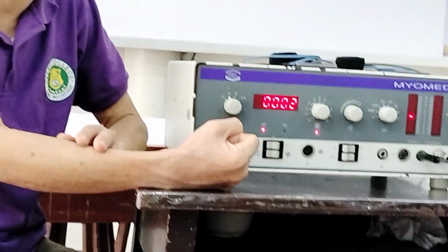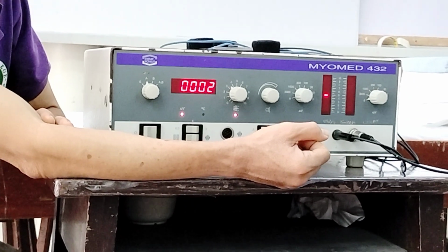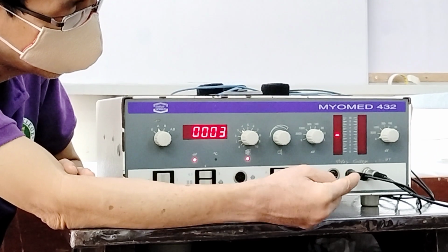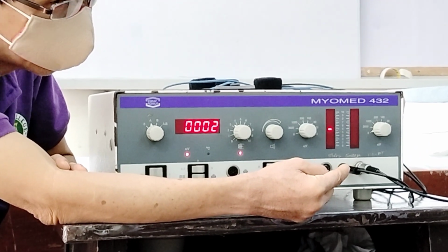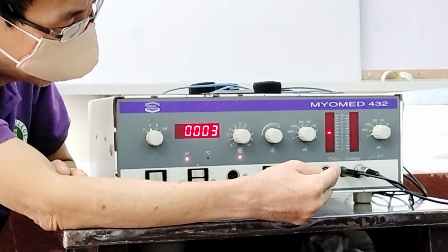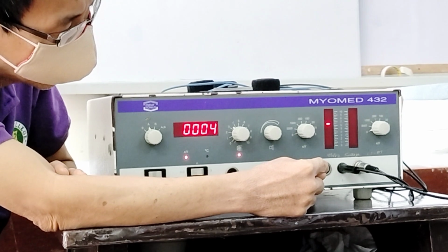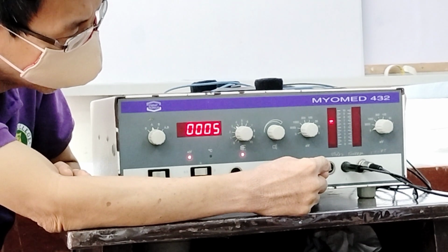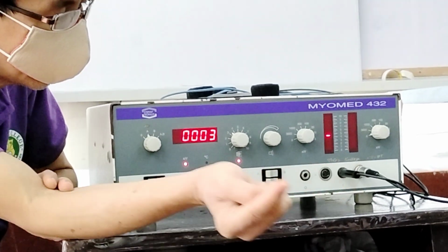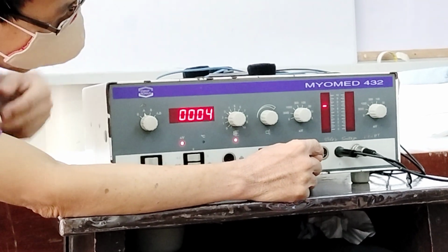When the patient bends the wrist, observe that your bar increases. From 4.5, it increased up to level 7.